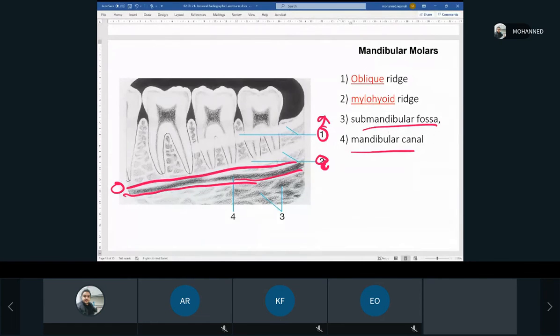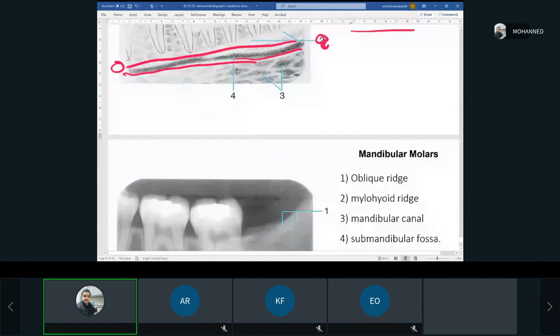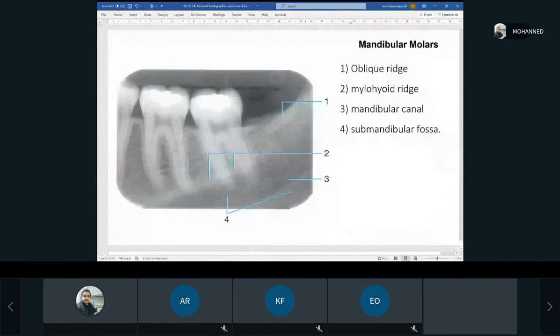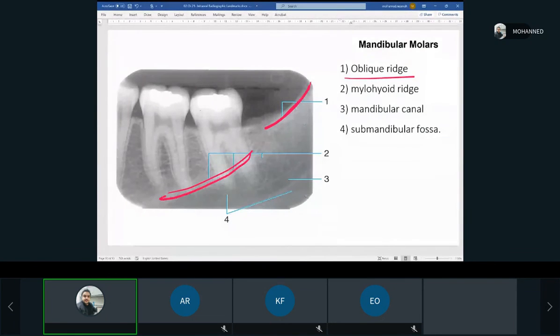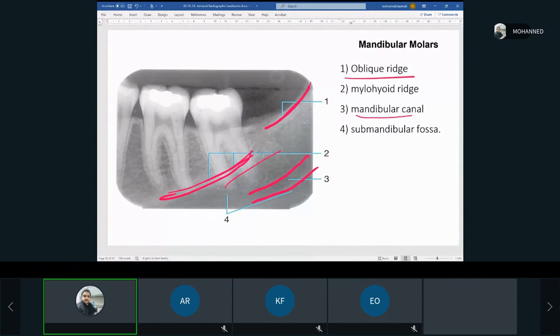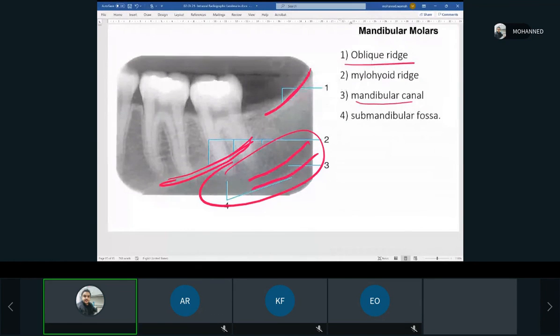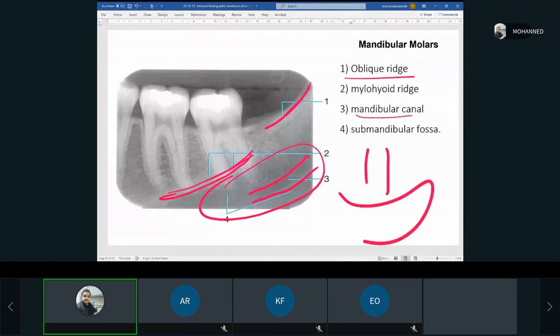On the mandibular molar x-ray: number one is the oblique ridge, number two is the mylohyoid ridge appearing slightly lower and more faint, number three is the mandibular canal visible clearly, and number four is the submandibular fossa. That concludes all the major anatomical landmarks covered in this chapter.